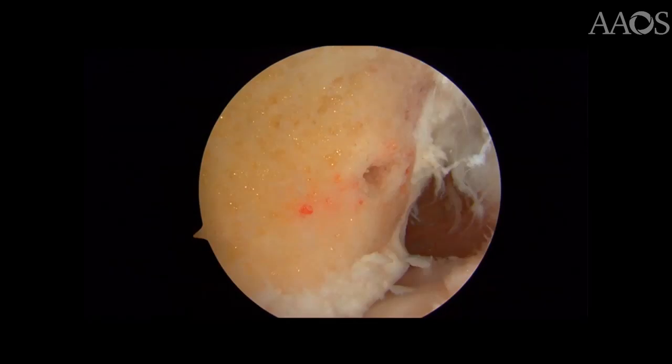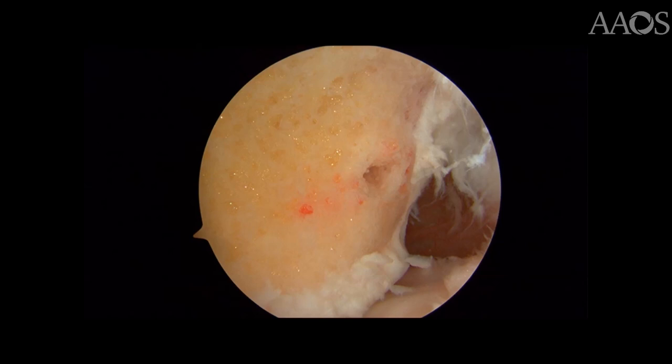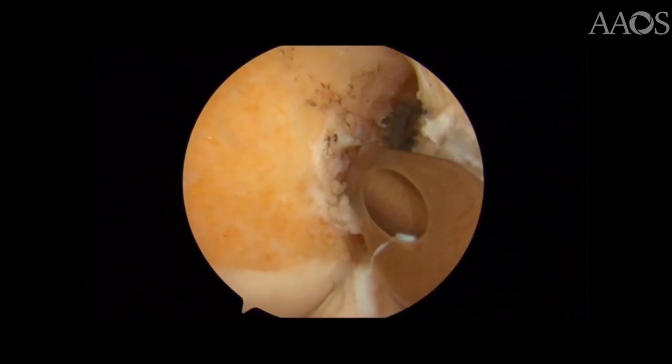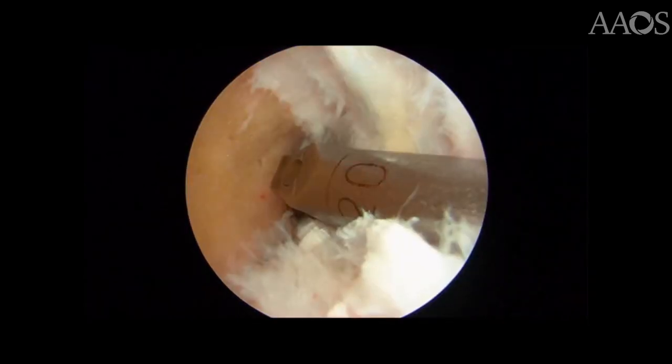A good view of the starting point is ideal for anatomic femoral tunnel placement. Good visualization allows for an accurate perspective of femoral tunnel positioning. Alternatively, a femoral guide can also be used to create a starting point for an anatomic femoral tunnel.